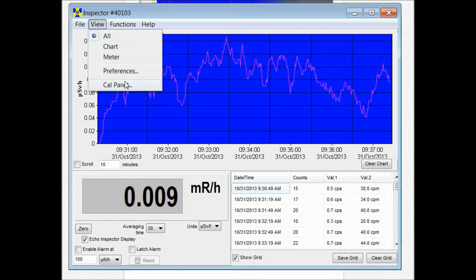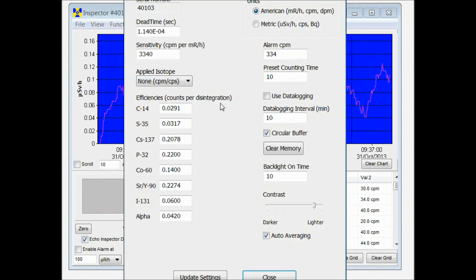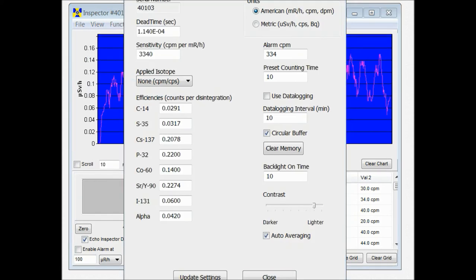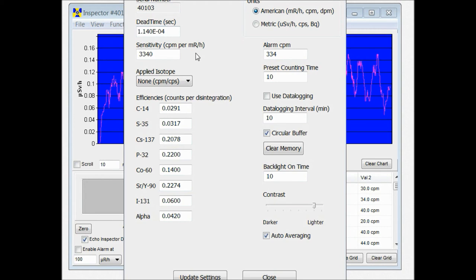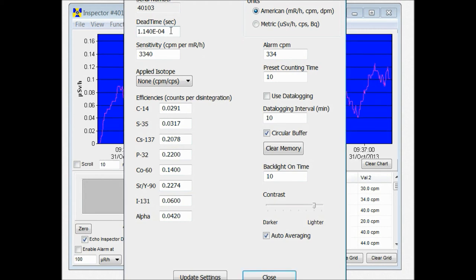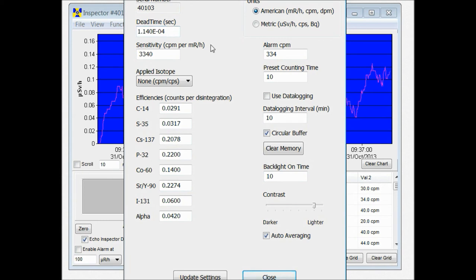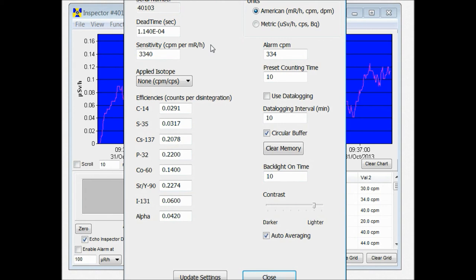We also have the cal panel. In the calibration panel of the Observer USB software you can change a couple of the features here. You want to be sure to leave the dead time and the sensitivity alone unless you really know what you're doing. Because that could mess up the calibration of your unit. Especially if you have an NIST calibration. If you reset the defaults via the utility menu on the unit itself, it'll retain the calibration.